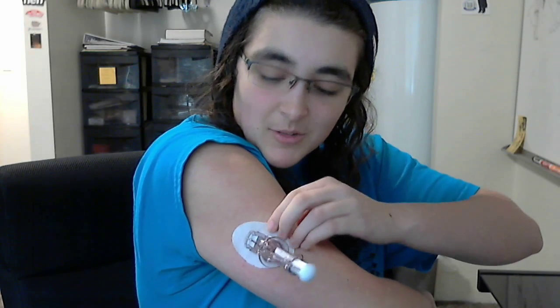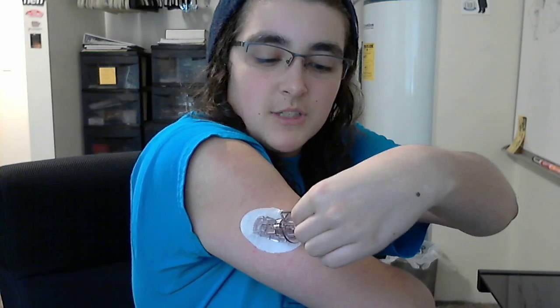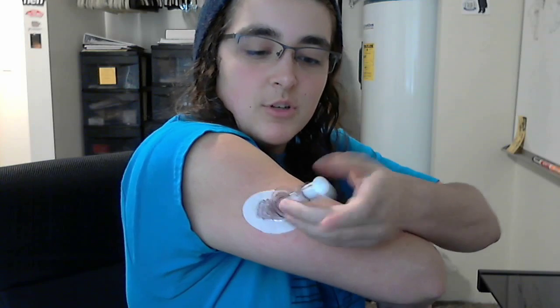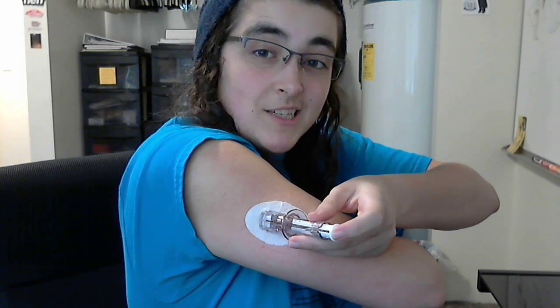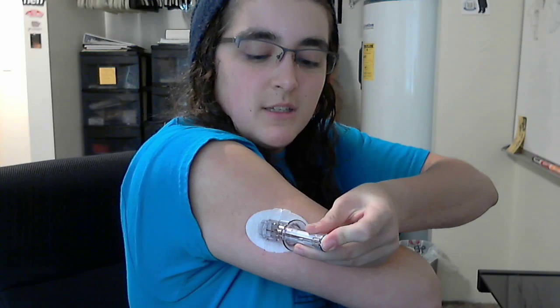The bad thing about this is once you kind of select a spot, you can't turn back. The adhesive goes down and it won't stick very well if you take it off. So I just removed the safety, and so I'm just going to push this needle into my arm. It's going to be pretty painful. I hope that's not the case this time, because on video it's kind of painful. I'm just going to push it right in.